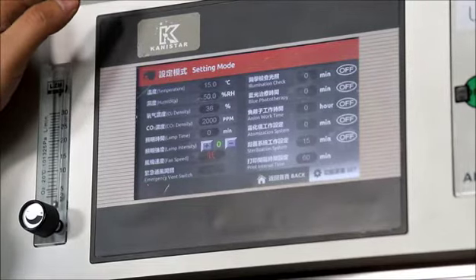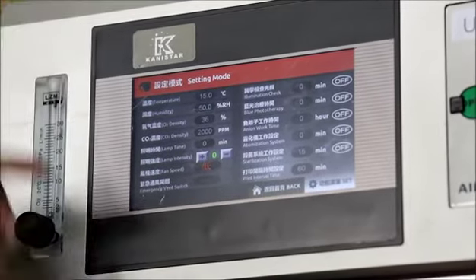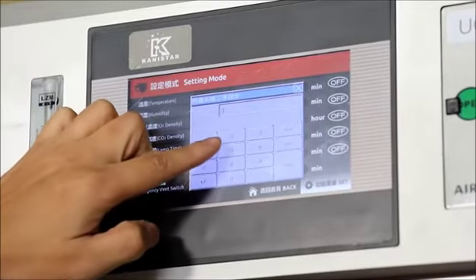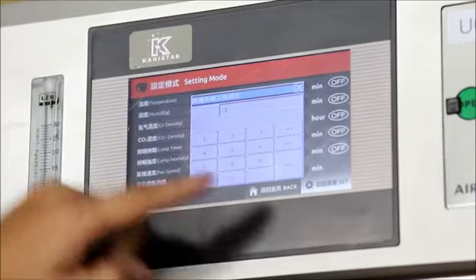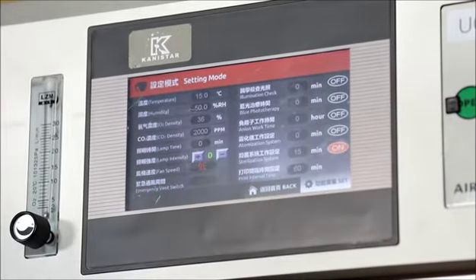To use the sterilization function after warp, we need to set the working time first. Say we enter 15 minutes — the adjustable range is from 0 to 90 minutes. Enter and quit, then press this button for switching on.